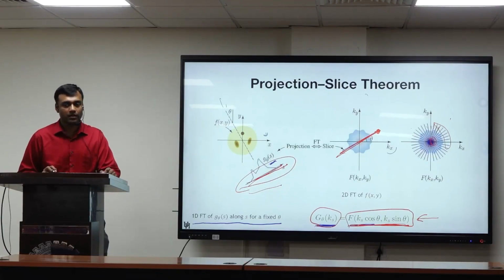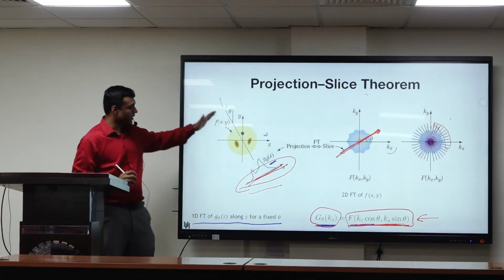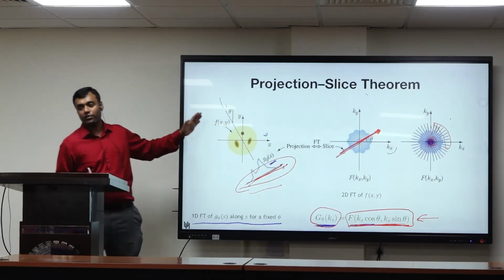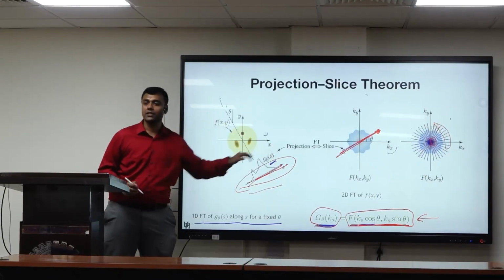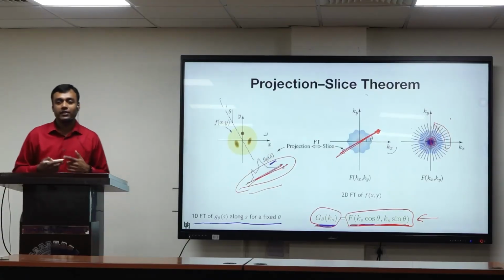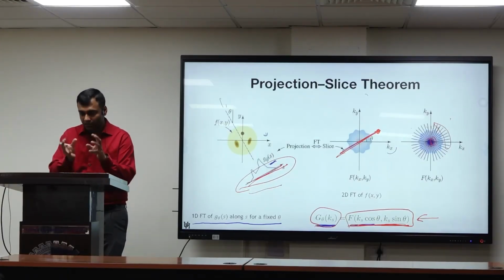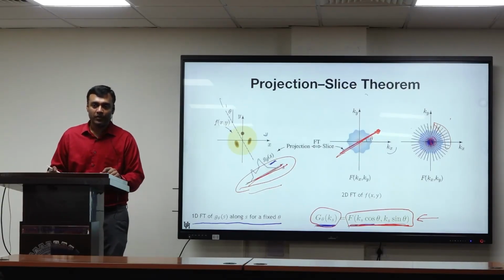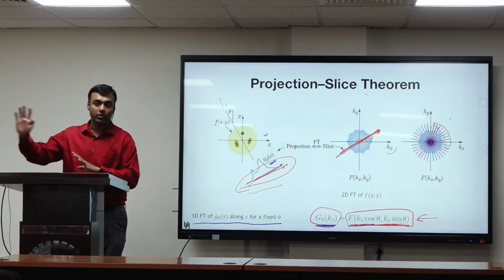Not quite. Think about it a little bit more, and you'll realize you can't do that. Even though we have done the rotation of coordinates, and it's uniform after the rotation as well, the pixels are equally spaced, but because it's an r-theta to xy kind of transformation, there is always going to be some preferential weighting where the middle is weighted more heavily. You'll realize quickly that you can't get uniform r-theta from uniform xy.